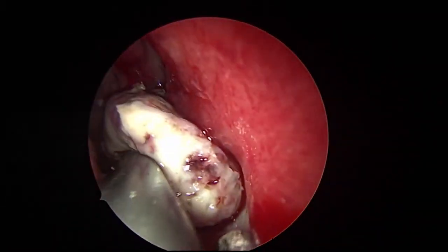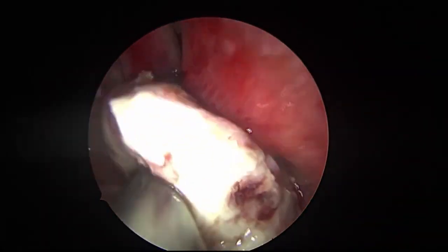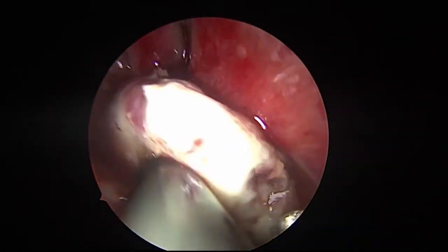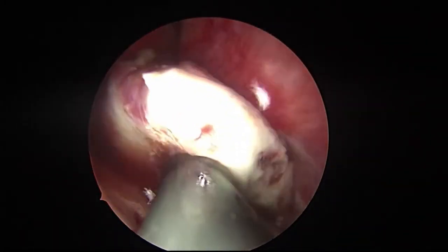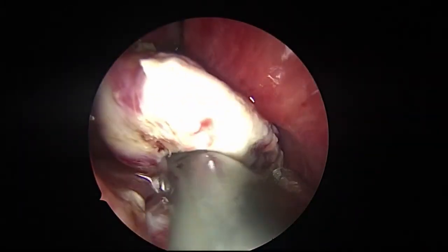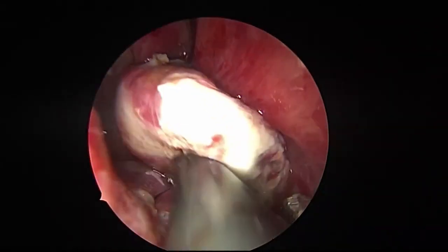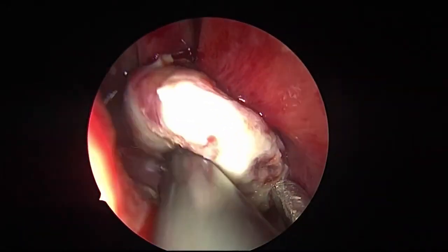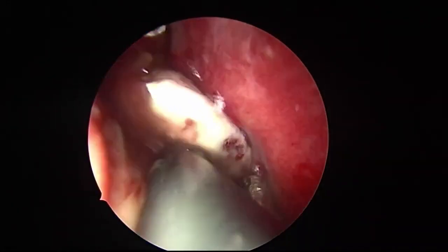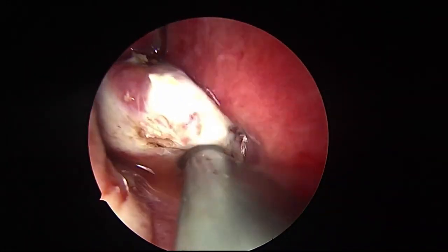See what I am doing? Surface coagulation. Whenever more and more surface of the tumor comes into your visualization, do more and more surface coagulation. This will not only reduce the vascularity, but more importantly, this will shrink the tumor and give more and more space.